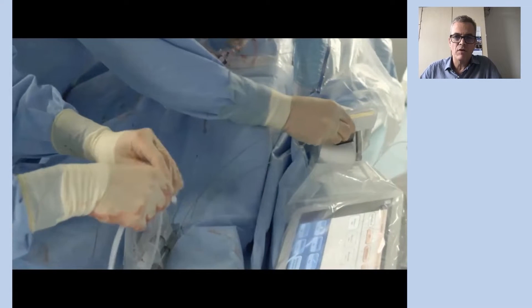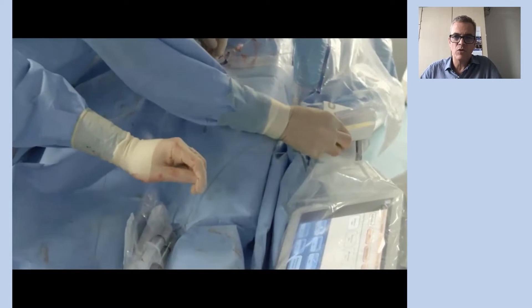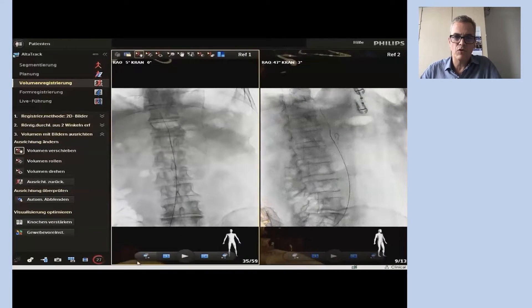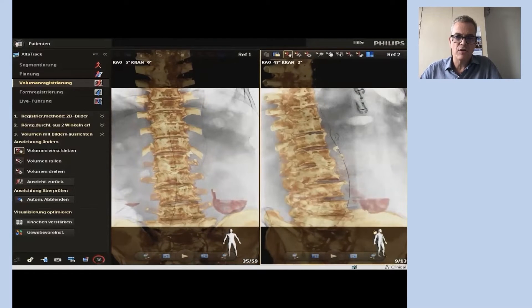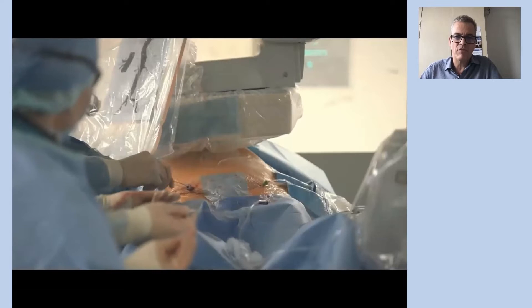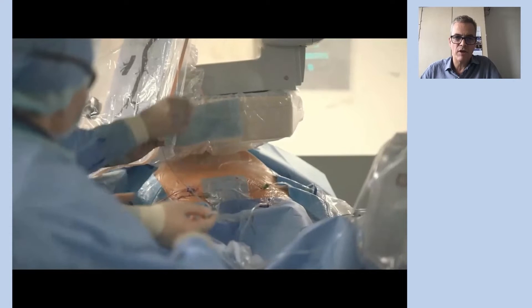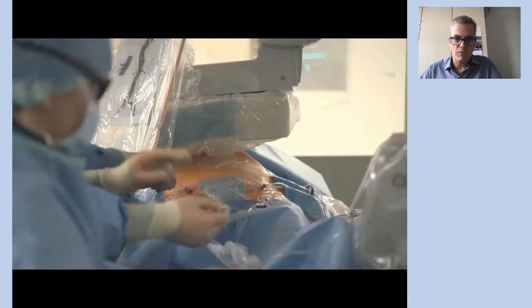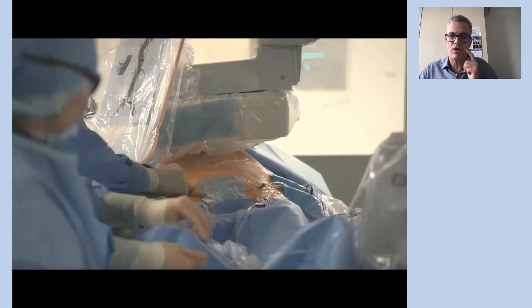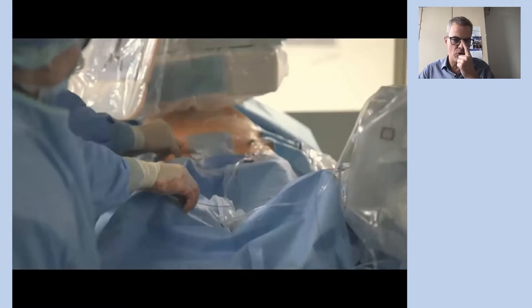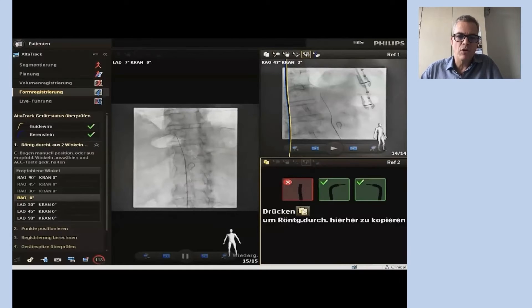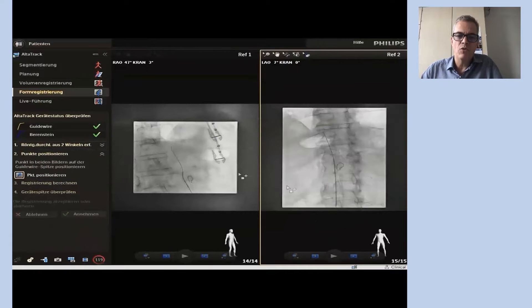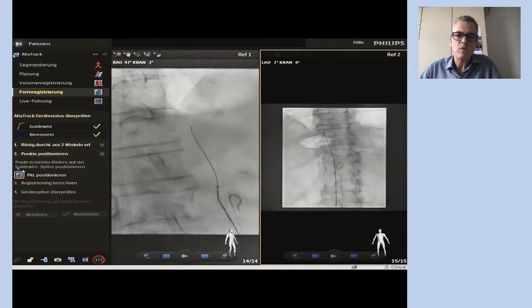Here you can see the setup of the FORCE technology. We use a FORCE wire and catheter that are registered shortly after the vessel navigator registration of the volume has happened. Here you see how the catheter and the wire are introduced for the registration, with a few clicks and two projections.